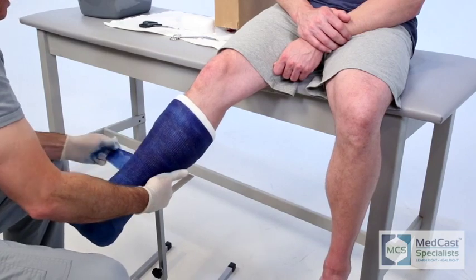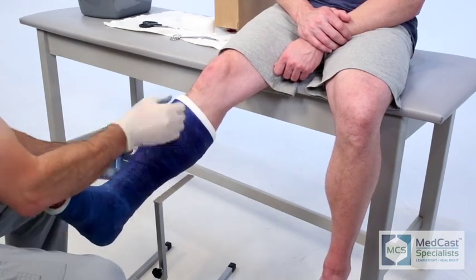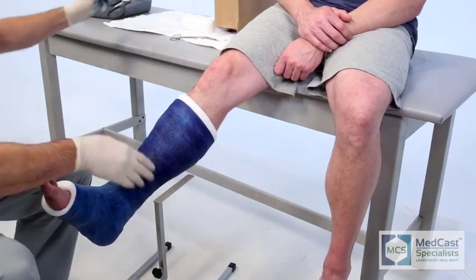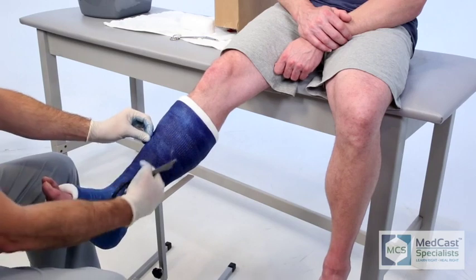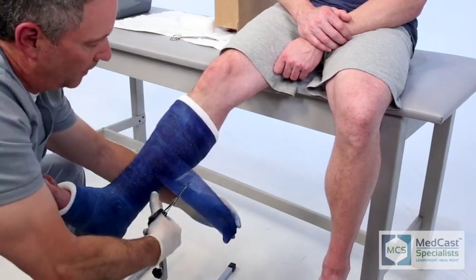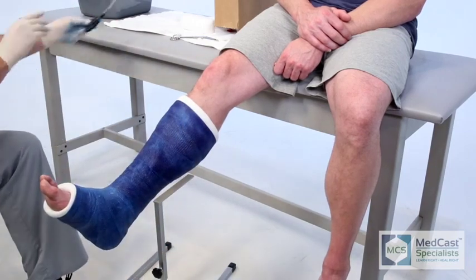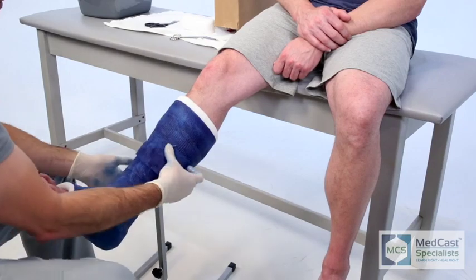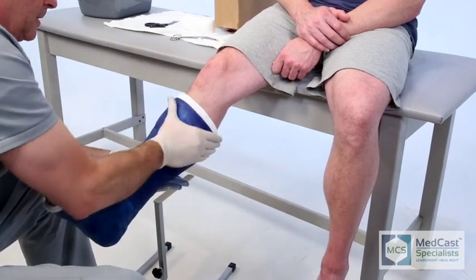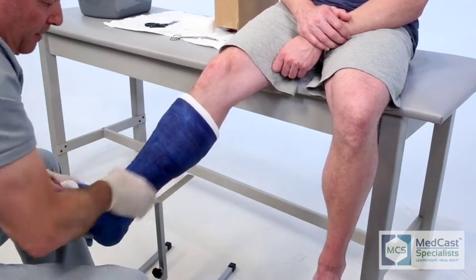On this final application of the cast roll, you can put a lot of tension on it — it takes out any of the imperfections, puts a little stretch into the fiberglass, and gives it a really nice finish. Factory edges usually don't laminate as well, so we like to cut those off. The last thing you want is your end-of-roll edge coming back up, especially on a pediatric patient — they'll just sit and pull at it and try to unravel it, and it ends up being a bad experience for them.